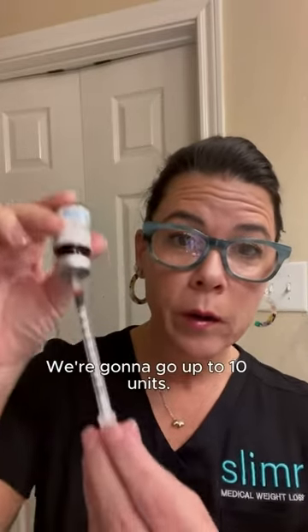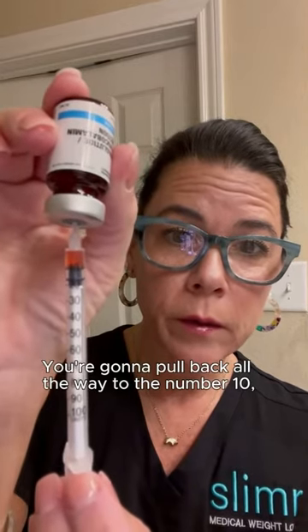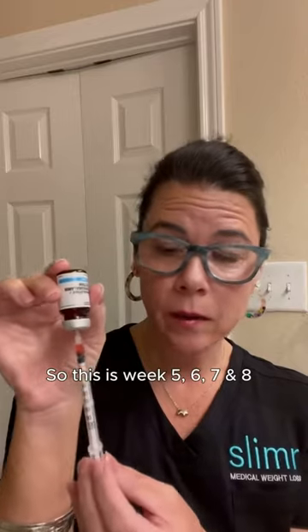Now it's time for week five — we're going to go up to 10 units. You're going to pull back all the way to the number 10. This is weeks five, six, seven, and eight.